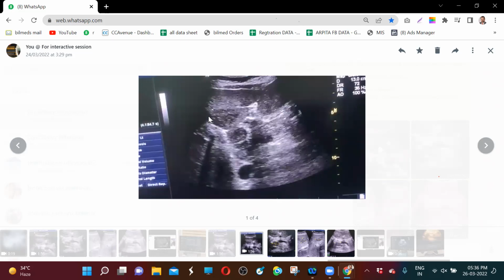Yes or no? Hurry up, Dr. Swapnil, hurry up. Sir, I don't remember, sir. You don't remember? This case is already gone. This is past. In future, whenever you think this is looking like a focal spared area, but 100% I cannot say, I have to put a Doppler onto this area, and if I see any mass effect, then that is a 101% suspected case. And if there is no mass effect, you know how to see for a mass effect, then only I can label that as a focal spared area.